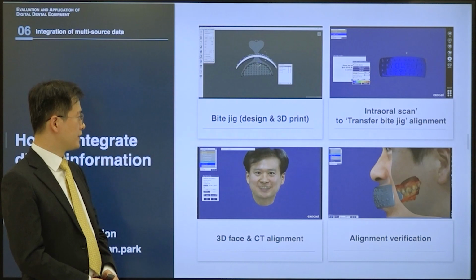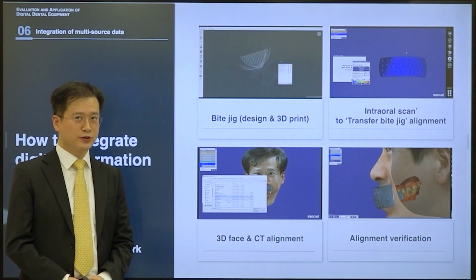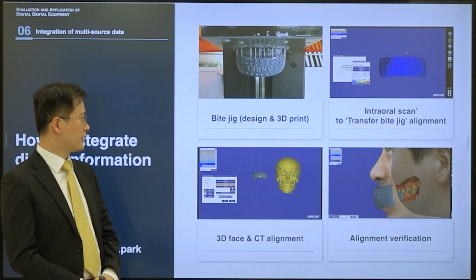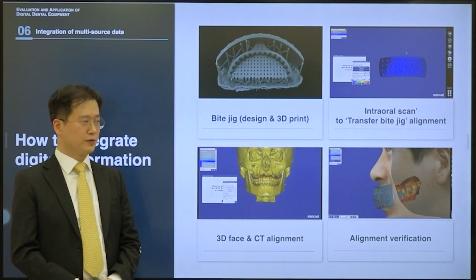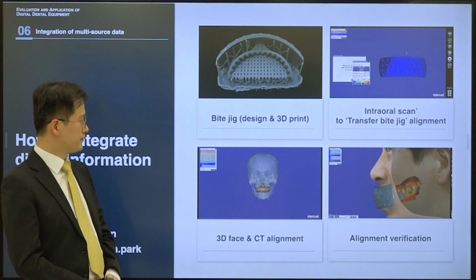In this technology, the alignment is very important, and I can show you how we can accurately align multi-source data into a virtual patient.